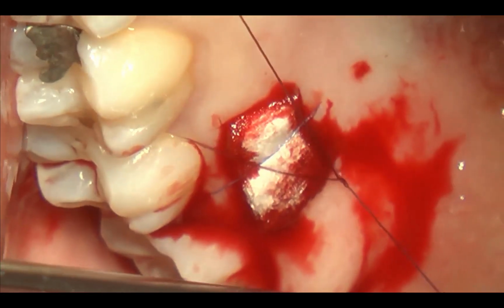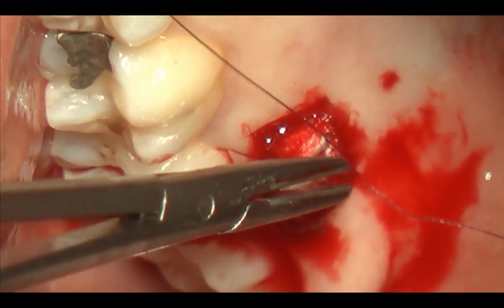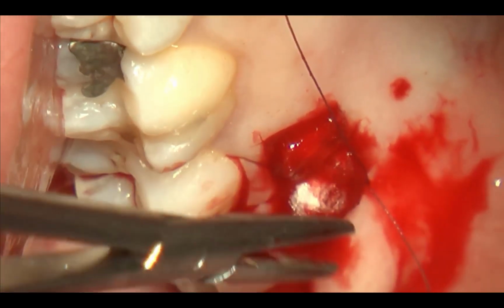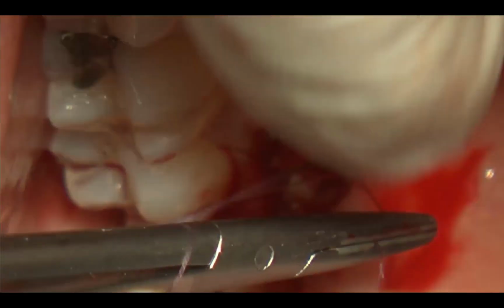Okay. The knot should be closed distal and apical, so we can block any vessel coming from distal and apical, and at the same time we can stabilize with a compressive suture the collagen substitute.